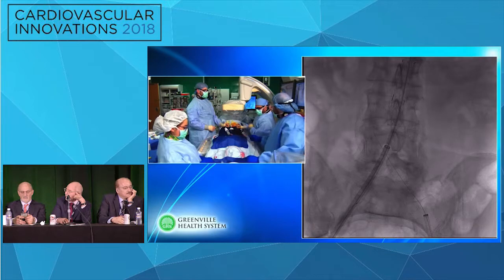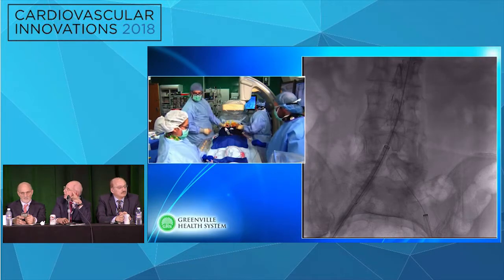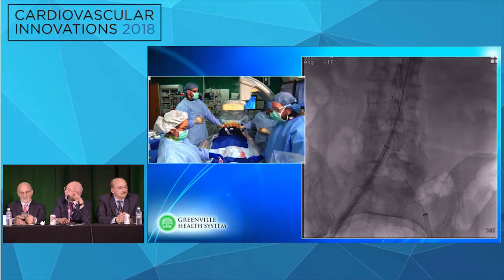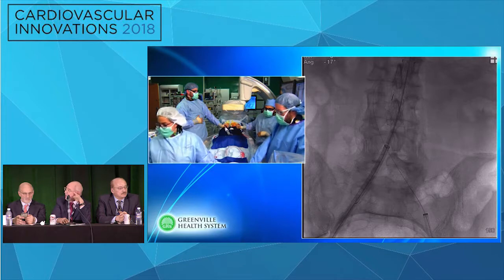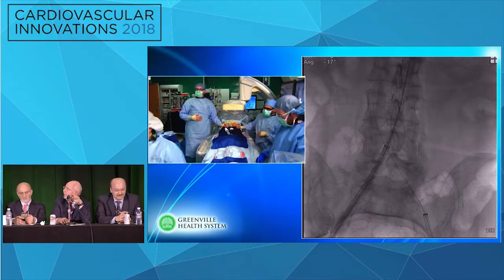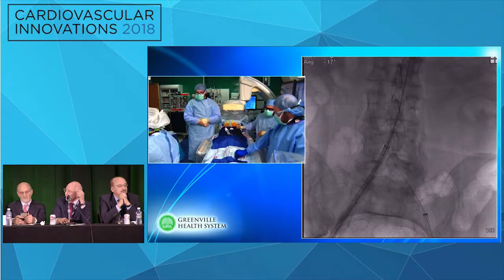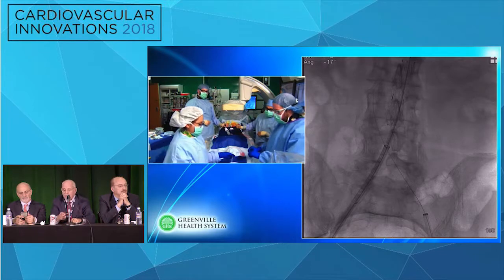And I think it also will help many of our cardiology colleagues who are using the various catheter support devices, the Impella device particularly, because we've seen at our labs a number of pretty significant vascular complications, and then they come to you afterwards and say, hey, can you help me with this? How can I get this out? And so they've reinvented the wheel of complications, at least in our experience, and the MANTA device may be able to help us with that. We're looking forward to having it available.